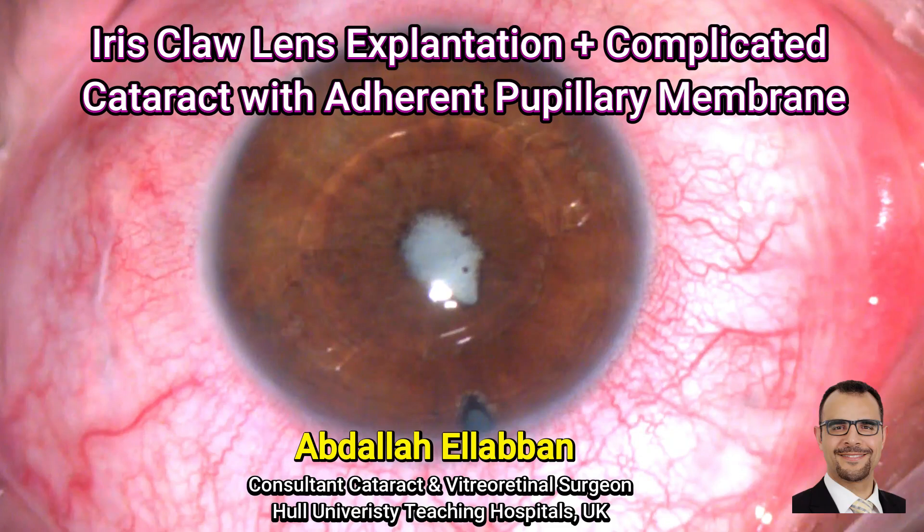Iris claw lens explantation with complicated cataract and adherent pupillary membrane.